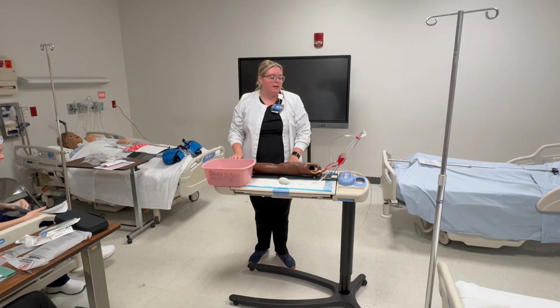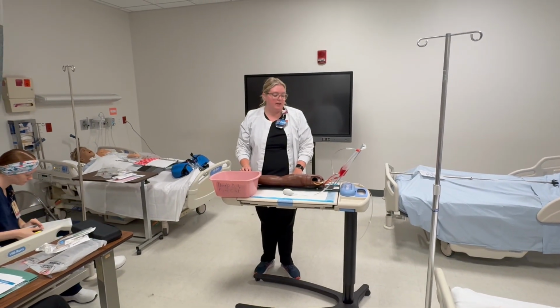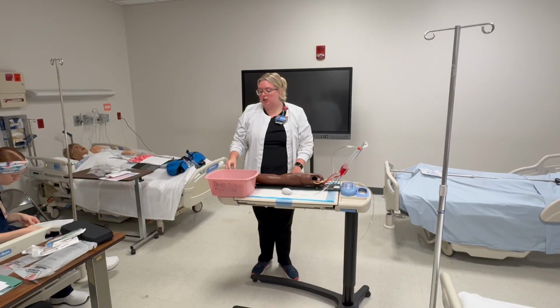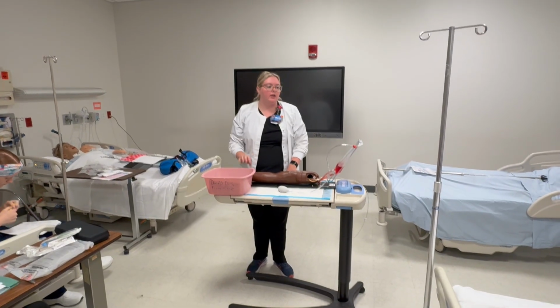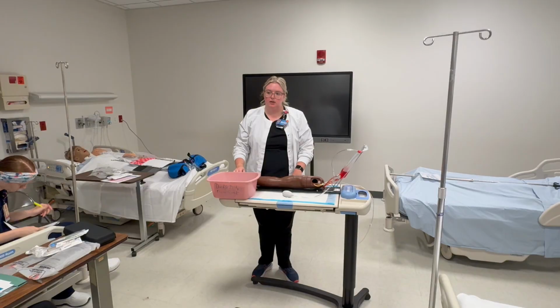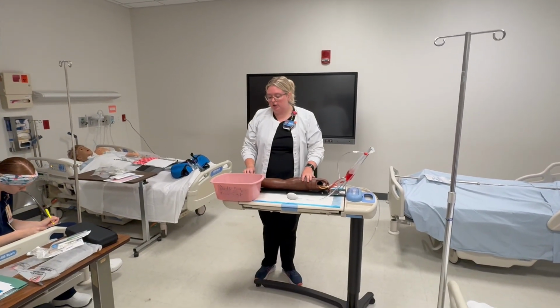They tell me. Today we're going to be putting in an IV. It's a little plastic piece that sits in your vein so that I can give you some medication. The 2 medications you're getting are normal saline to replace some fluid to hydrate you, and gentamicin, which will help fight your sepsis infection. Okay? All right, do you have any questions? Nope, he doesn't have any questions.